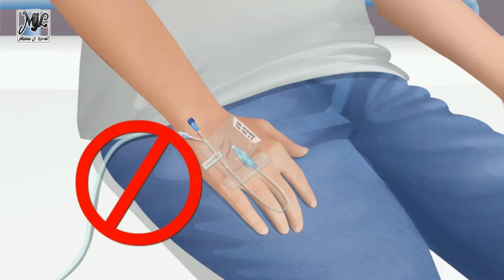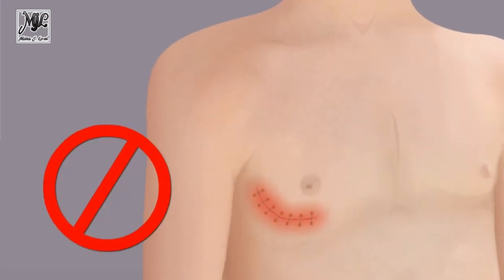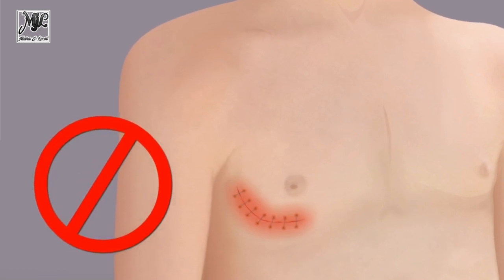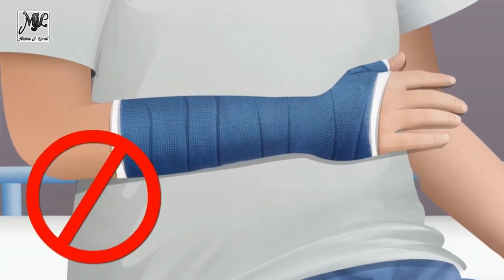Select the best site for measuring blood pressure. Do not apply the cuff to an extremity that has an IV catheter, an arteriovenous shunt, trauma, inflammation, or disease, or a cast or bulky bandage. Also, avoid an extremity ipsilateral to recent breast or axillary surgery.